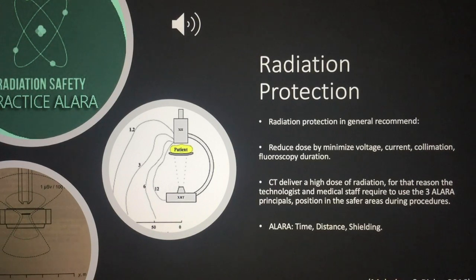Radiation protection in general is recommended. Practice the three principles of ALARA: time, shielding, and distance. Reduce patient dose by collimating, using the proper technique and the right position, and stay safe, and make sure that your patient is safe.